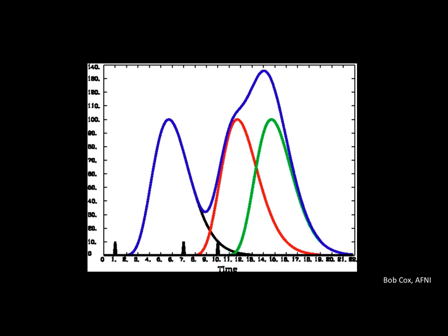Add some noise on top of that, add even more events that are overlapping, you get a very, very messy signal. Okay, so remember this, fMRI data is mostly crap. It just is. It's super messy. There's physiological noise, there's scanner noise, the subjects move, the subjects breathe. Basically, the subjects show signs of life, which is very inconvenient because it messes everything up. The BOLD signal is not always reliable. We're looking at a bunch of different places. There's things like spatial correlation, temporal correlation. It's crazy. So we need a lot of trials to just get a good grasp of what's going on for a single condition.